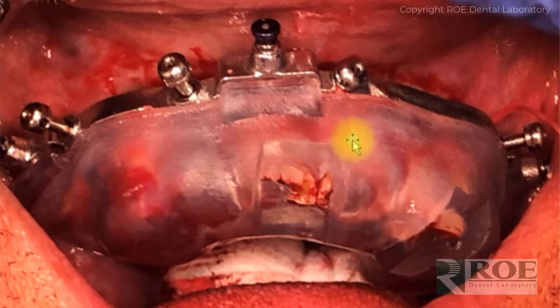And then they are assembled. The fixation base, the metal, and the pin guide, the plastic, are assembled with the chrome locks. They're inserted and they are held firmly in place while the sites are drilled. So this would be a situation where the assistant and the doctor would hold this pin guide firm. It can't move. It can't rock. And if there aren't many teeth remaining, then it's partially tissue supported.